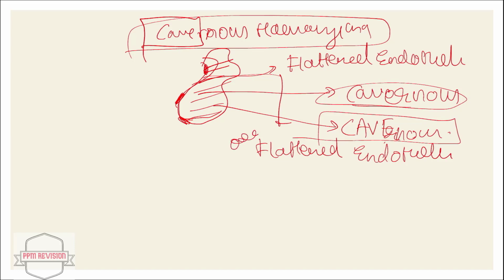And there's also presence of the normal liver tissue that can also be seen along with the structure. Presence of normal liver tissue can also be seen, right? So now just recapping a few points. That is subcutaneous cavernous hemangioma. There's a structure of the skin.